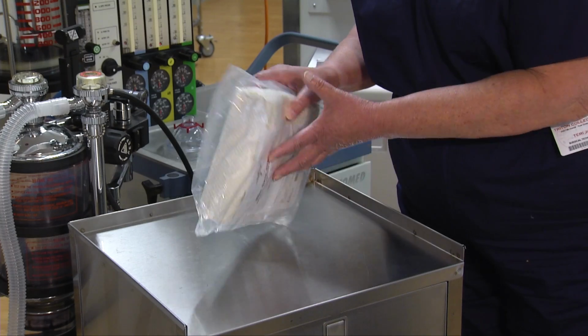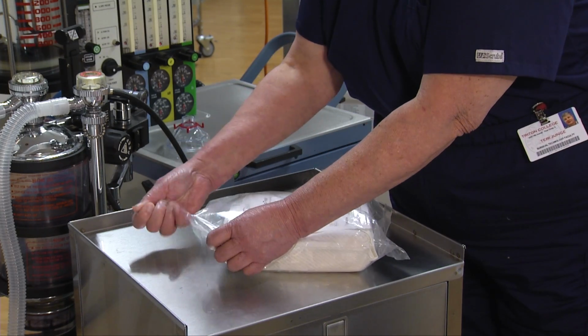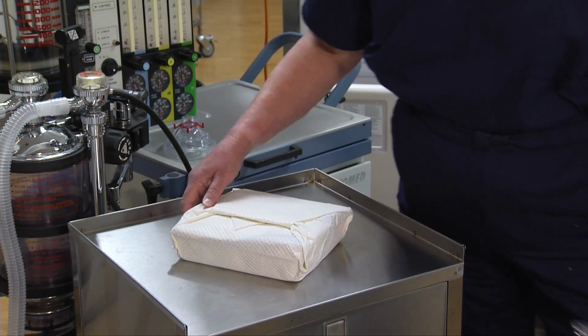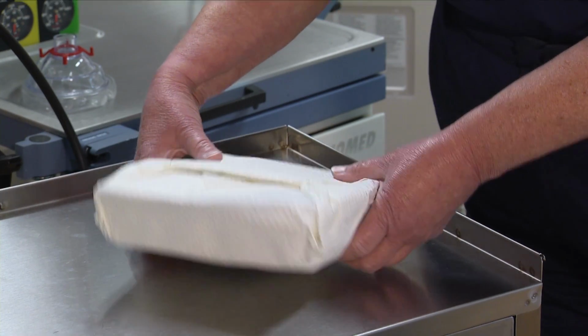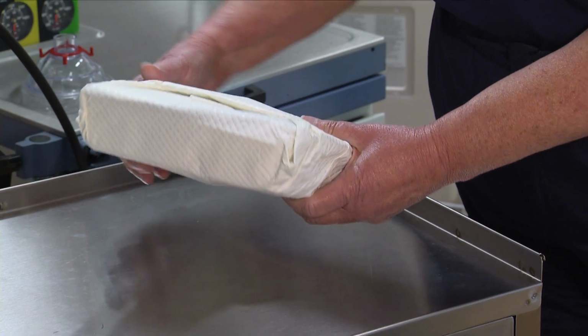Inspect the outer wrapper, which is sometimes called a dust cover, to be sure that it is intact and then remove and discard it. As the dust cover is removed, verify the integrity of the inner wrapper to ensure there are no holes or watermarks. If any damage to either wrapper is noted, the item should not be used.